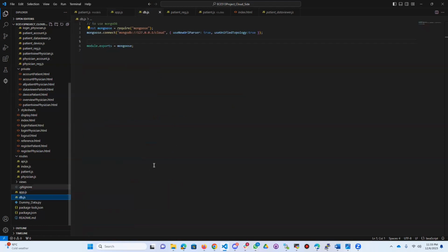And then if we move to the DB here, the database, this code establishes a connection to a MongoDB database named Cloud running locally on the default address. It then exports the Mongoose object, making the MongoDB connection available for use in other parts of the application.